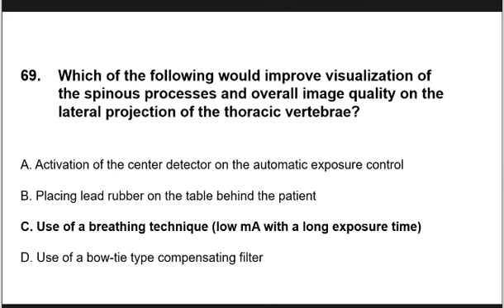So paano yun, sir, pag nagkabaliktad, no? Kung ang cathode side ay nakafocus doon sa thinner side, thinner. Ibig sabihin, kung ang cathode natin ay nakafocus doon sa manipis na area, paglabas ng image, syempre maitim. No? Kung ang cathode side nasa thinner area. So kung ang anode side nasa thicker area, in other words, mas lighter naman ang labas, ang outcome ng X-ray field. So that is the lateral projection of the thoracic vertebrae.